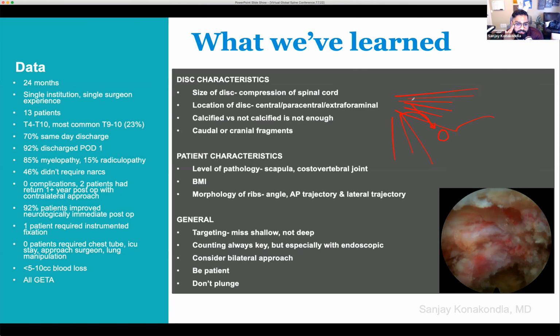If I did have it in plans for that, I would probably locate the area of the dural opening. An inlay gel foam has really been advocated for in the endoscopic community, and then either fat graft or muscle graft plus a dural substitute plus glue is probably a good combination to help with that.